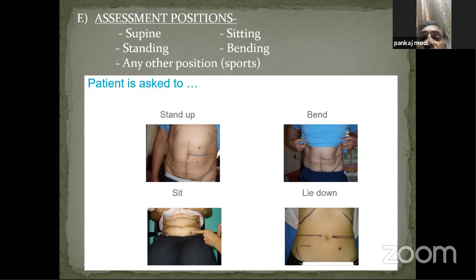Remember, there is no difference as far as parastomal hernia or anything is concerned. Do you understand? It will be the same. It depends upon so many factors. We'll come to that later on. But the important point you should keep in mind is closure. Because when we are talking of stoma positioning, as far as the closure is concerned, it should also be kept in mind. And it has been observed that we are very used to doing an oblique one. The reason is that it creates less muscular weakness. Do you understand?